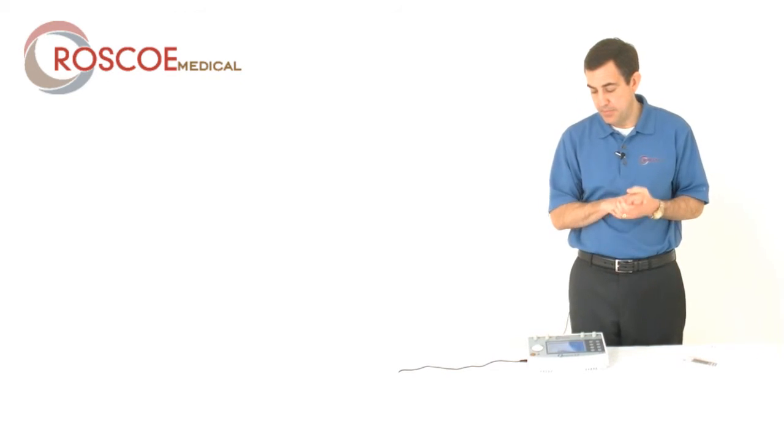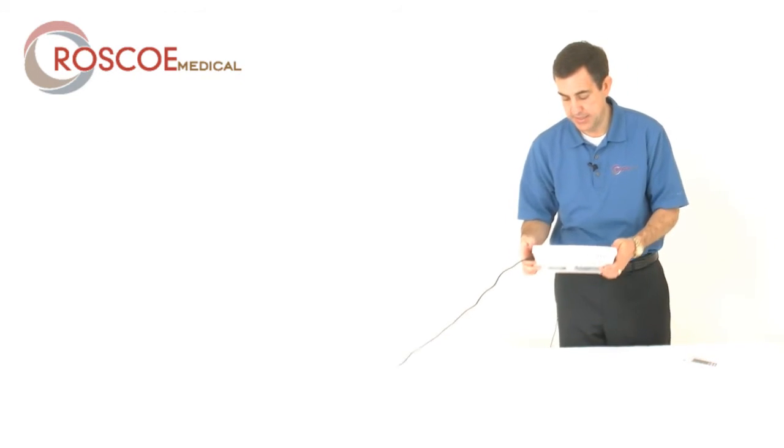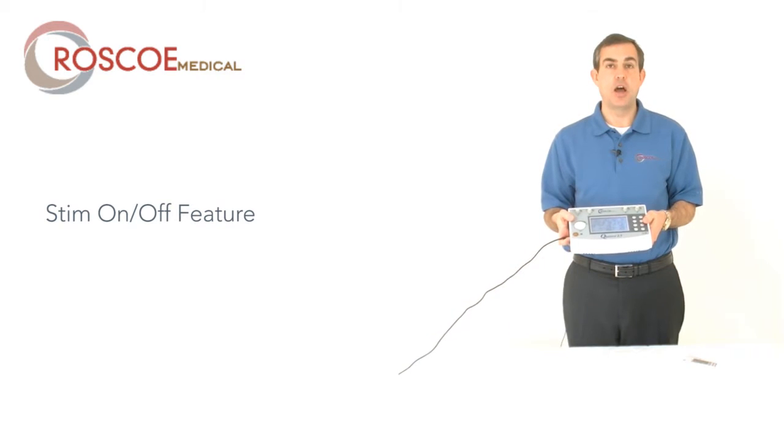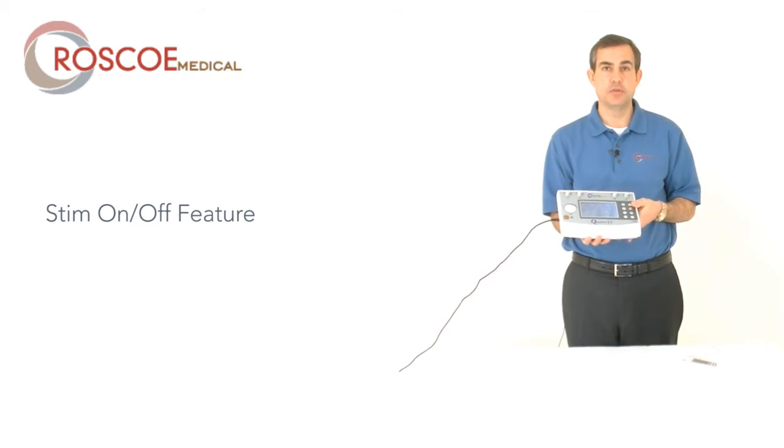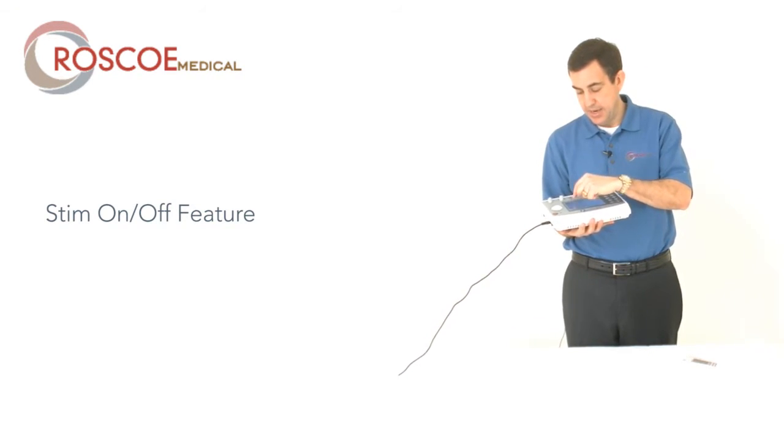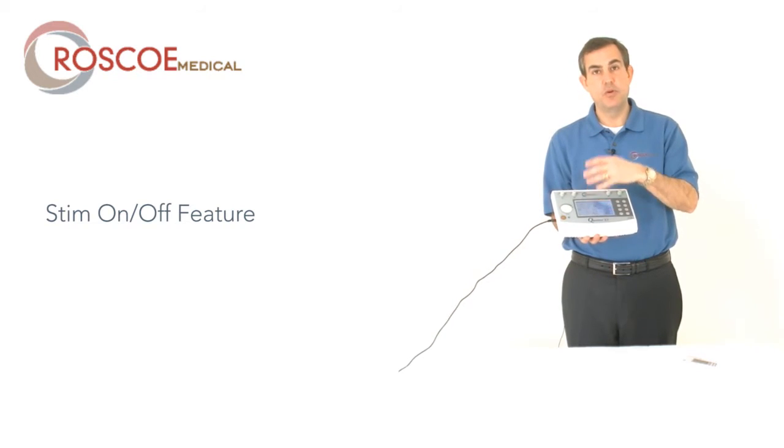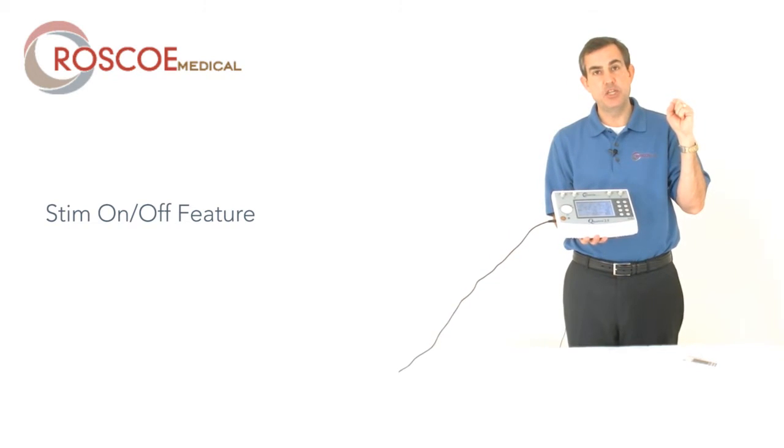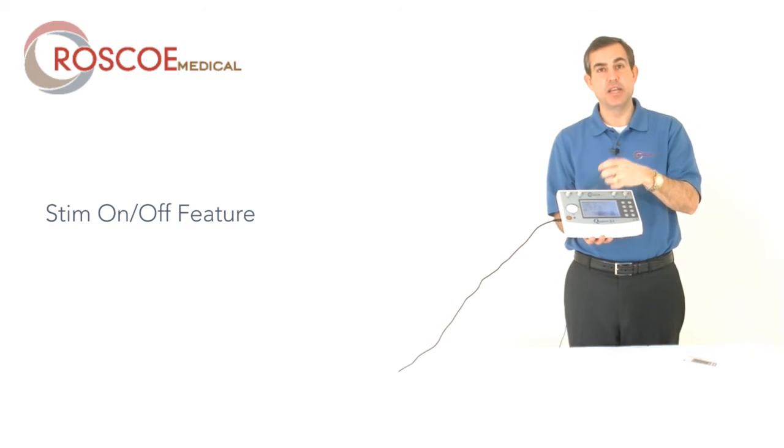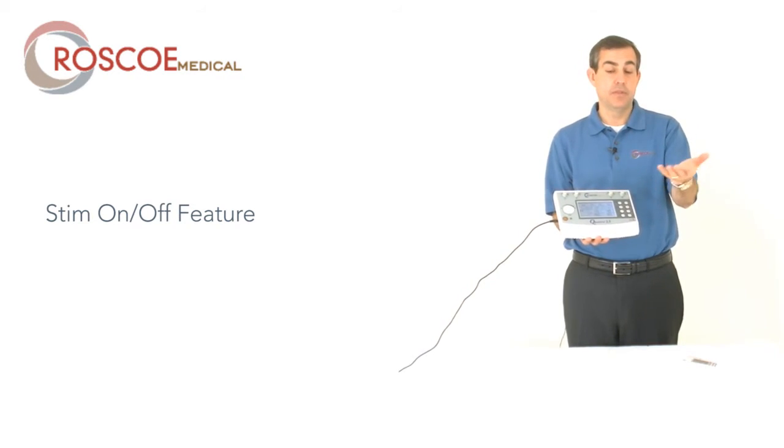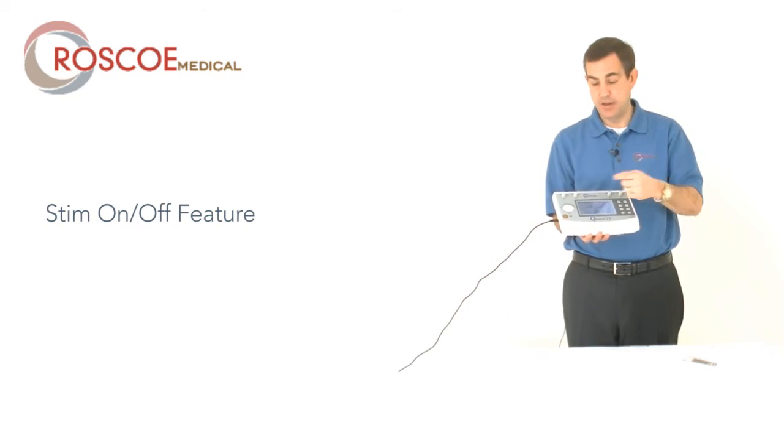So another big advantage that we added is the stim on-off feature. I'm not sure how well this will look in the video, but in EMS mode and Russian mode, when the patient or end user is getting stimulated, before there was no icon on there saying stim on or stim off, so the therapist didn't know when the patient was experiencing stim without feedback. That could be tough.